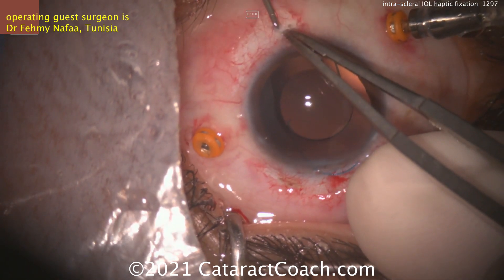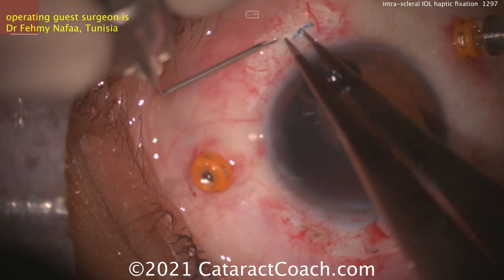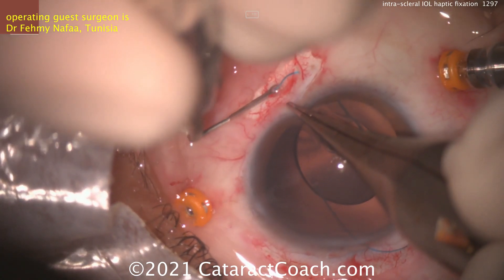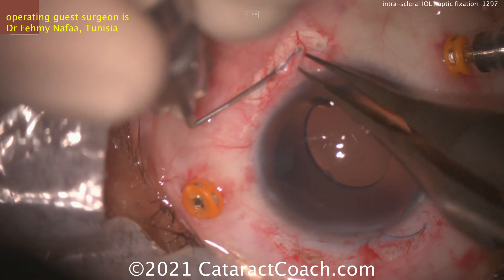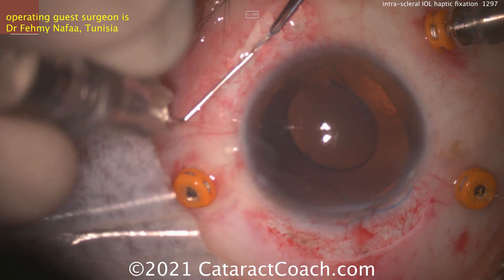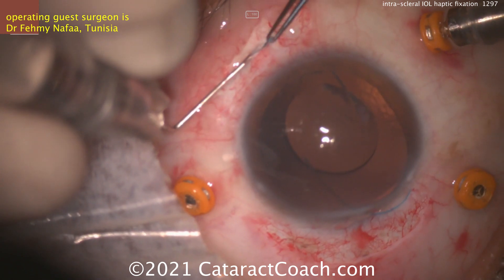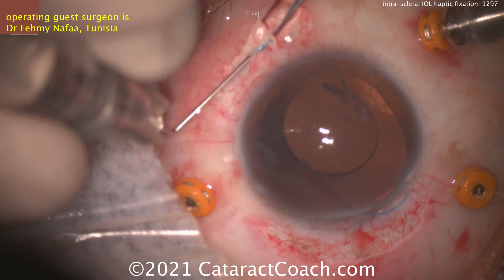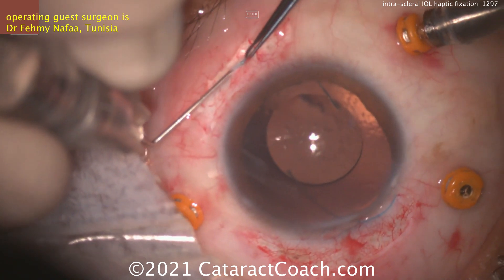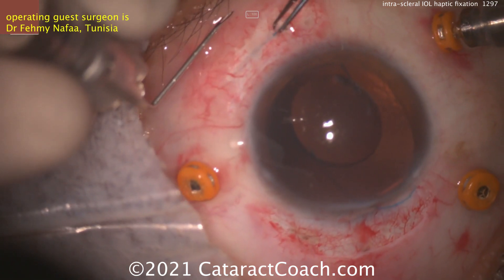Pulling it through carefully, being careful not to damage the haptic. There it is — pull it out a little bit. Now a tunnel is going to be created. He's not using a flap like you would for the Agarwal glued IOL technique — he's just making a straight tunnel. The idea is to feed this haptic into that tunnel, feeding it into an empty 30-gauge needle and pushing it through. Now you've trapped that haptic into an intrascleral tunnel — this is the Shariath technique, and that haptic is going to be nice and stable.